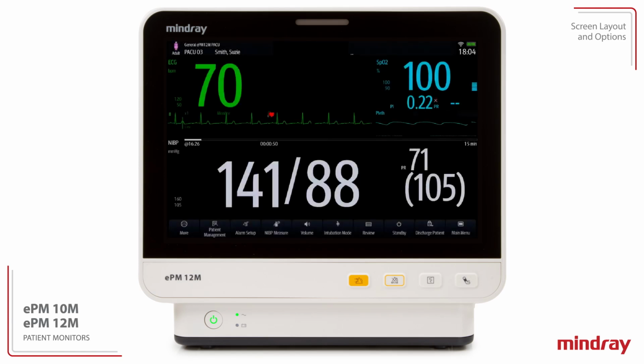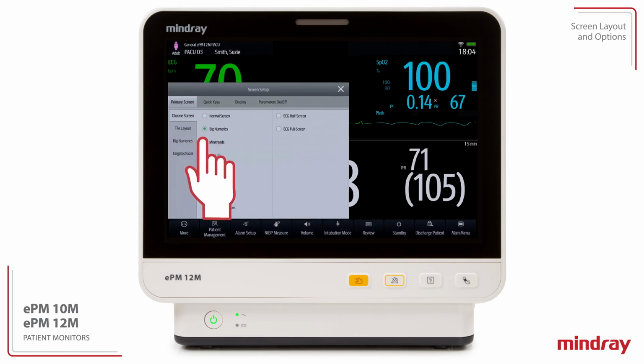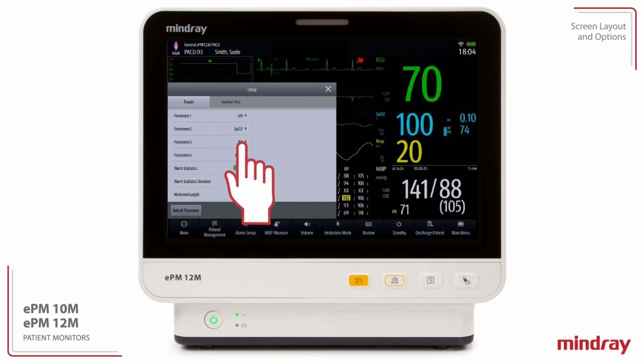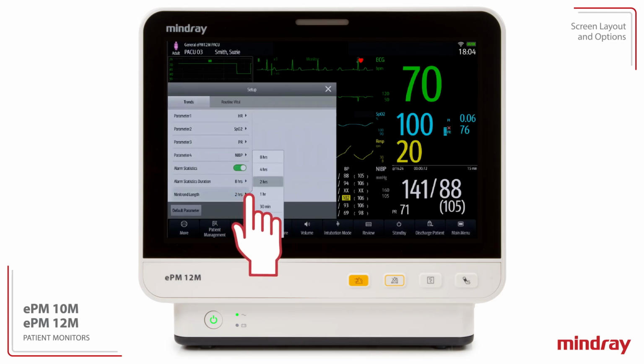Select Mini Trends in the Choose Screen tab to review or adjust parameters and physiological alarm information in a graphic trend format. Choose the Setup button in the lower corner. Select the arrow adjacent to the parameter and select the desired parameter. Select the arrow to the right of the mini trend length to adjust the time length.